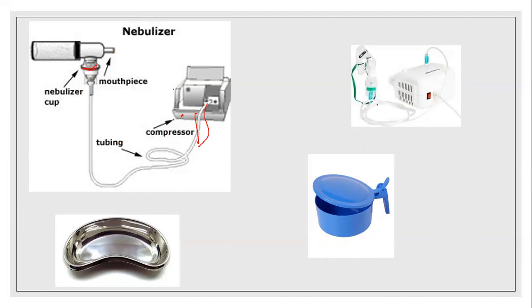So this is a nebulizer with a nebulization mask. We put the nebulization mask on the nebulizer. This is the connection area for the plug. This is the on and off button. This is the filter. The nebulizer is connected to the tubing — that is the nebulizer cup holder. This is the nebulizer cup, into which we have to pour the medication or disinfectant solution.